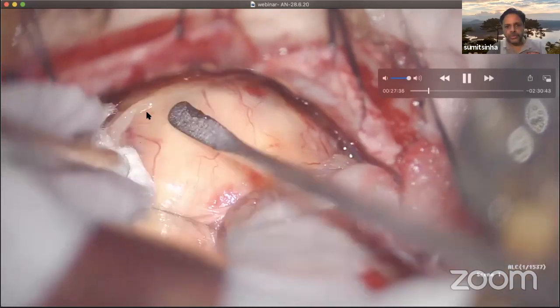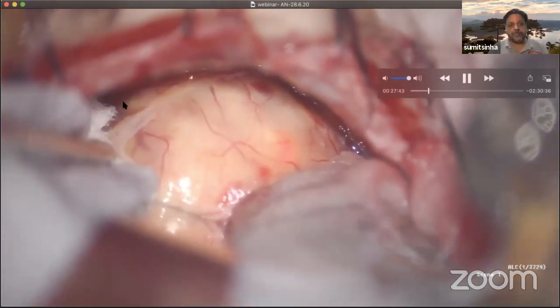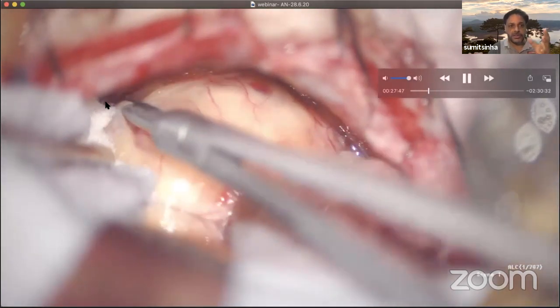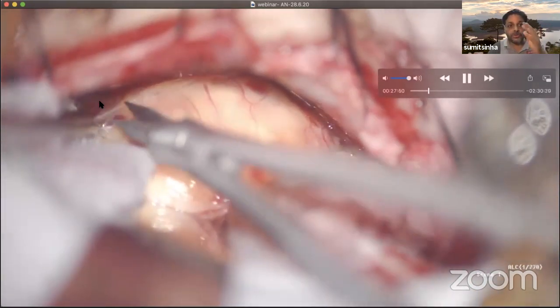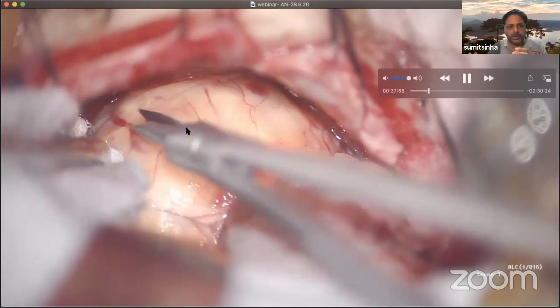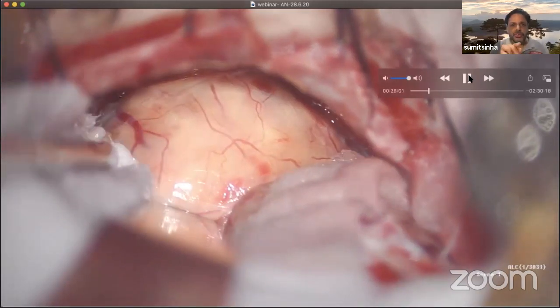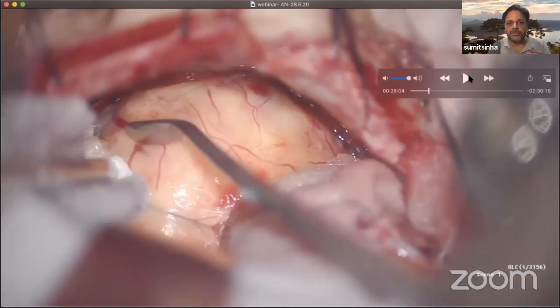You see, wonderful. I mean, these are the arachnoid membranes, and now all the neurovascular structures of the CP angle are here outside the tumor capsule, outside the arachnoid capsules. And so this is so important. While the tumor is inside, it is subarachnoid, it is inside the arachnoid membranes. The only structure, and this is a very important point I'm making, which is not outside the arachnoid is the seventh-eighth nerve complex, the meatal structures. The meatal structures are not outside the arachnoid. Hence, there is a need to identify and locate these meatal structures as early as possible in the surgery.